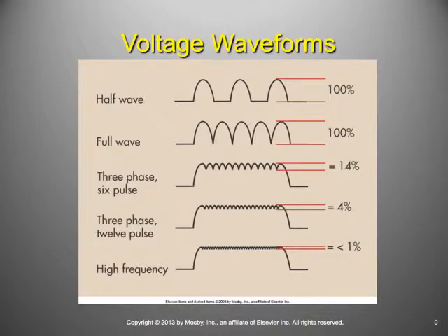and it's going to be less dose to the patient. Because if you can imagine, with all this ripple, I can't control that. Some of the rippling effects of the X-ray machine are just contributing to patient dose without actually giving me a better image, right? I'm going to have to actually increase my time. I'm going to have to increase my exposure to compensate for that ripple.